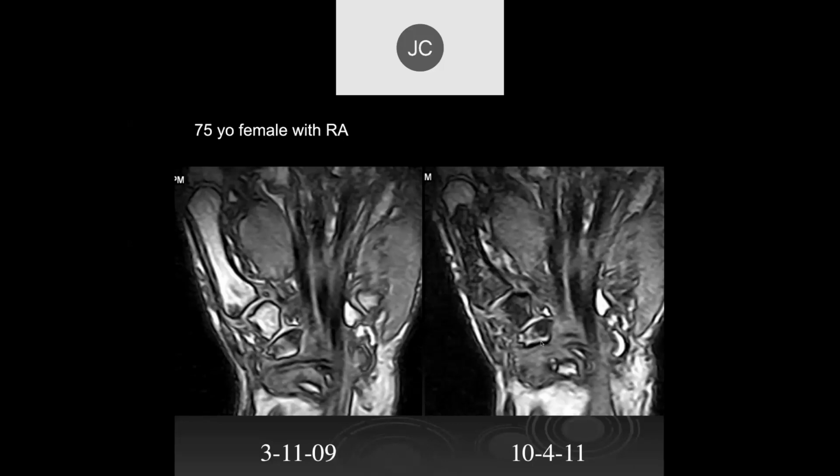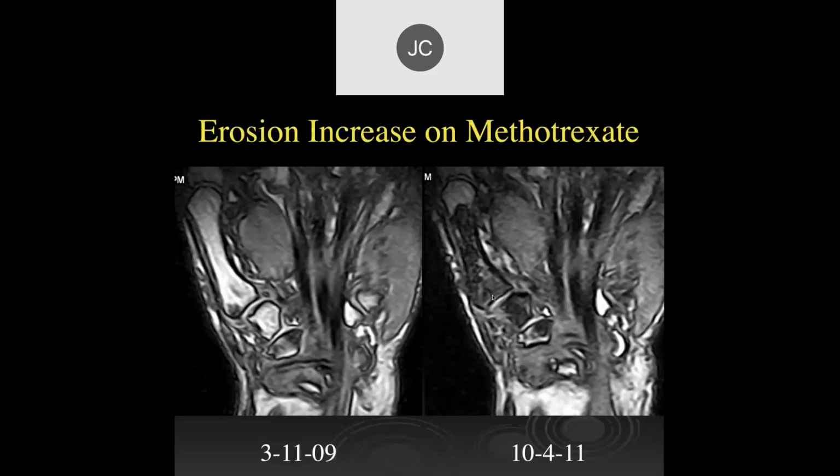And there were some studies a few years ago to try to use MR that way, but they were kind of inconclusive in showing MR being effective at doing that. But MR typically is used more aggressively in Europe than in the United States for a number of reasons that I don't want to go into right now. But MR is the technique of choice really to follow erosive changes, and these changes can become pretty massive if they're not carefully followed.